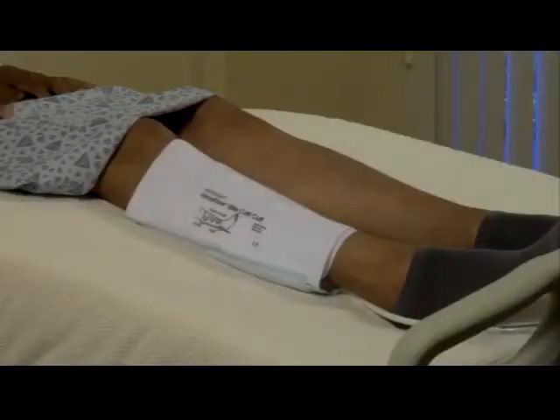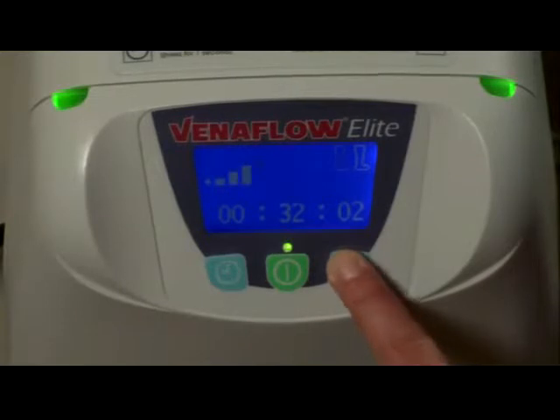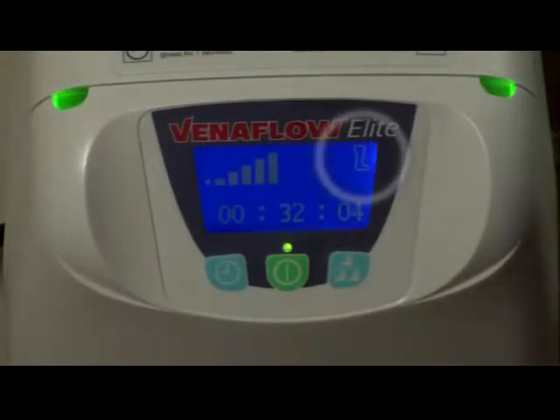During the three-minute ramp-up period, you must select single leg application if desired. Simply press the single/dual leg button and check that there's only one leg icon featured on the screen.